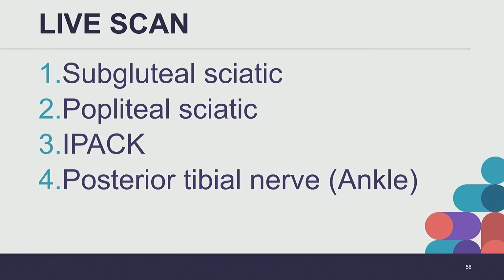All right. Do you want to do the posterior tibial nerve at the ankle? Yeah.